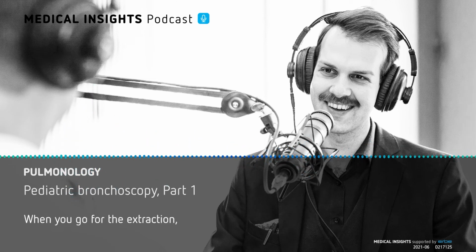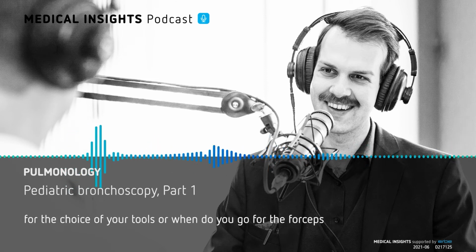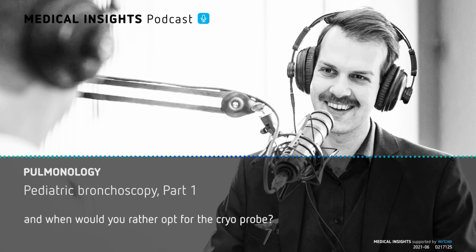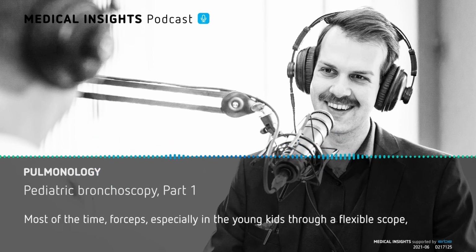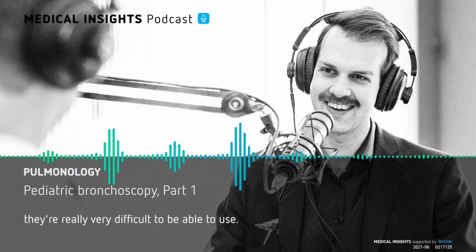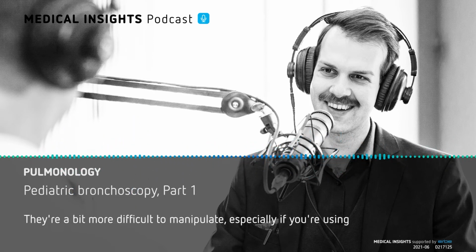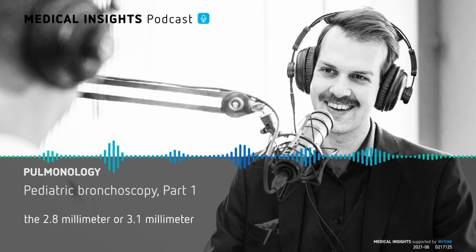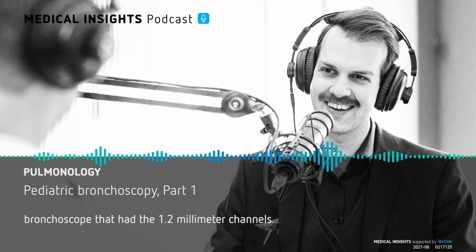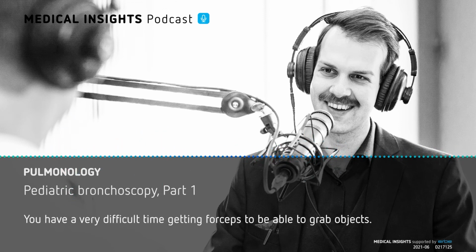When you go for the extraction, what's the rationale for the choice of your tool? So when do you go for the forceps, and when would you rather opt for the cryoprobe? Most of the time, forceps, especially in the young kids, through a flexible scope, are really very difficult to use. You don't have the grabbing power. They're a bit more difficult to manipulate, especially if you're using the 2.8 millimeter or 3.1 millimeter bronchoscopes that have the 1.2 millimeter channels. You have a very difficult time getting forceps to grab objects.